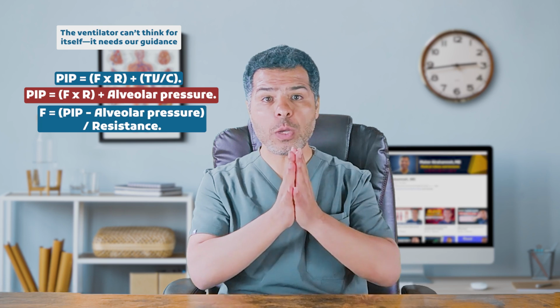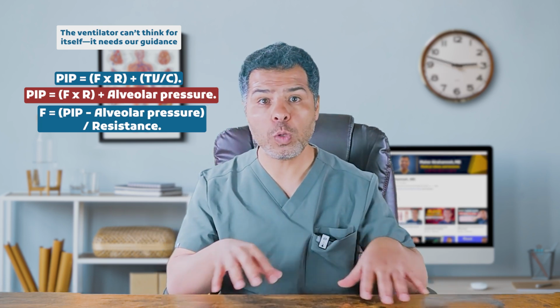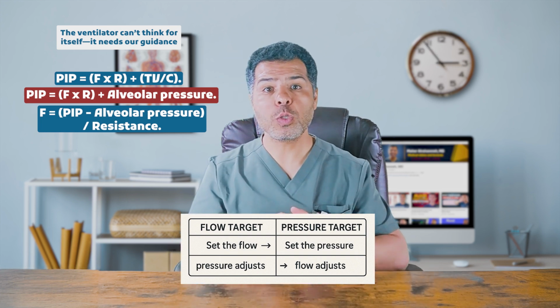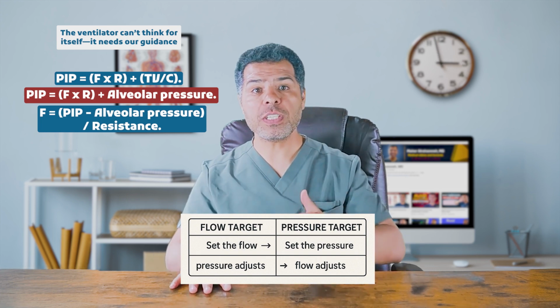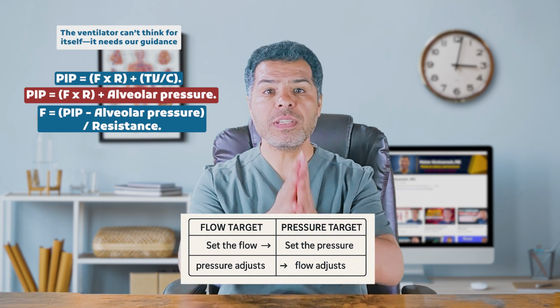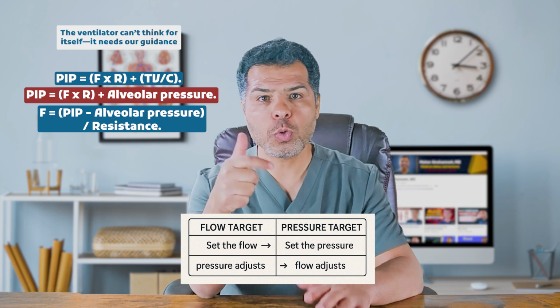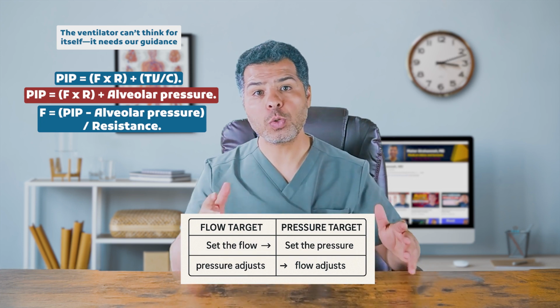Now, based on the equation, mathematically, for the pressure and flow relationship to hold true, we can only set one variable, either the pressure or the flow, but not both. That's because one of them must remain flexible to allow the other to stay fixed. If we fix both, the equation would not hold under changing patient conditions. This will leave us with one of two options to deliver the breath. You can either set the flow and let the pressure adjust, which is called the flow target, or set the pressure and let the flow adjust, which is called pressure target.